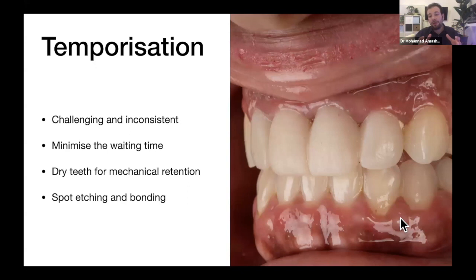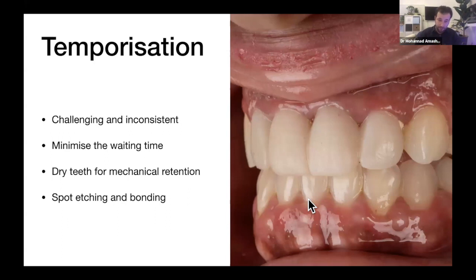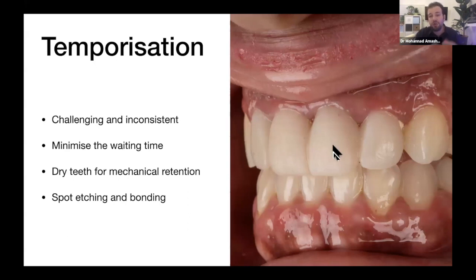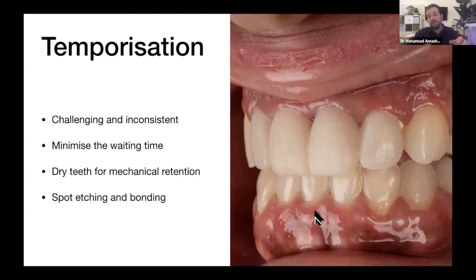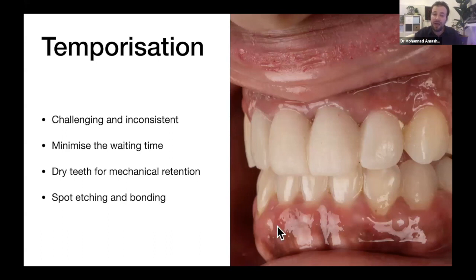Ensure there's good surface condition — not too wet. Place your material, then remove the putty by peeling it off, and hopefully the temporary will remain in place. You can also use spot etching and bonding: select two or three spots on the prepared tooth, spot-etch and spot-bond only those areas — not the full surface — then place your material. It will stick with chemical retention.